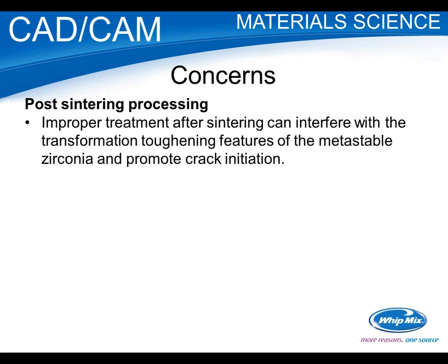Now, the concerns. Post-sintering process. Early on, there were a number of issues because labs and doctors tried to process it like they would a porcelain. So they grab their grinder and their burr and start cutting away to make the restoration fit, and that's a no-no for zirconia.